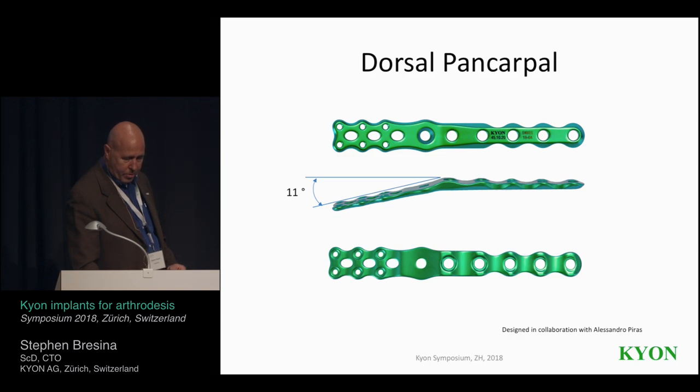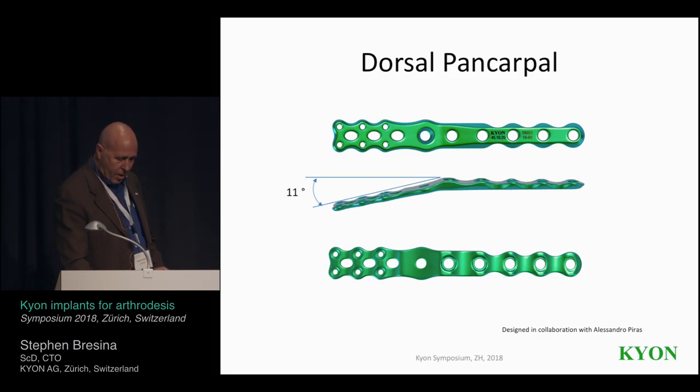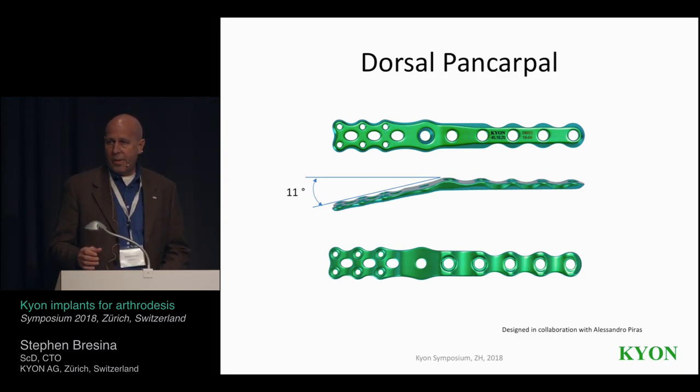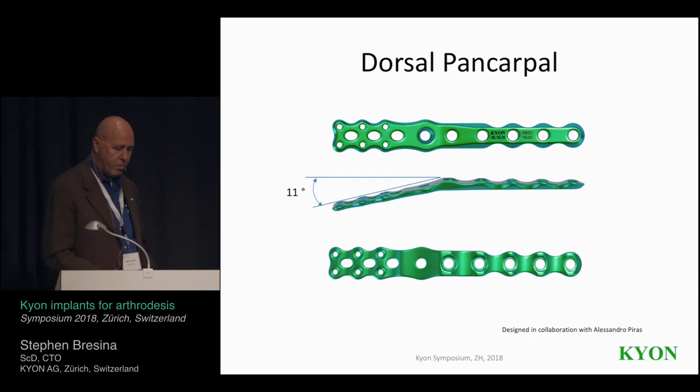Then going to the carpus, this is where we needed a specialty plate because anything from ALPS is too much of a profile distally. We thought, well, if we go with just engaging one metacarpal, we're going to have pretty small screws there, using a 2.0 locking screw. We thought that, well, we should probably engage two of them. We'll have much more stability. The negative to that is that then the metacarpals are locked together. They're not free. But since the carpal-metacarpal joint is fused anyway, we think that this is probably an acceptable thing to do.